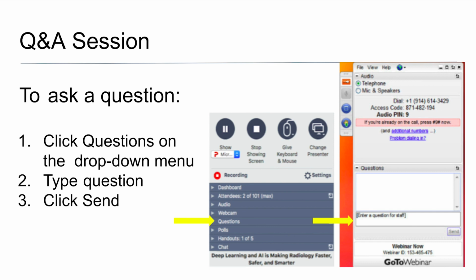Next question: at test time, do you need both an MR and PET scan or just a PET scan? If the scanner is PET MR, definitely using both PET and MR is the best, and we should also use the PET AC map, which definitely gives better results.